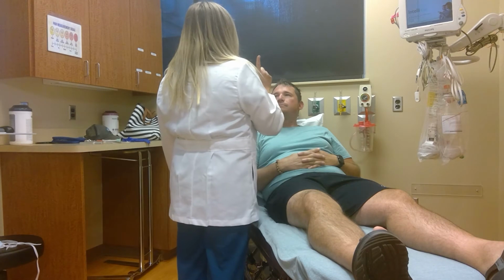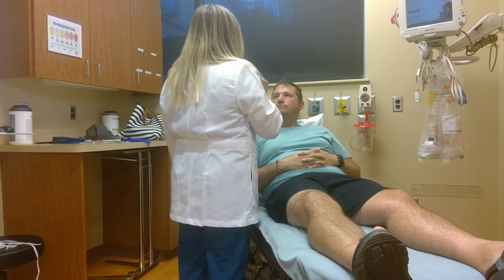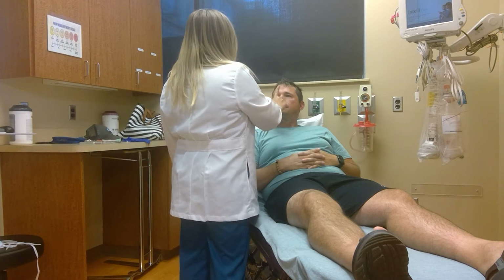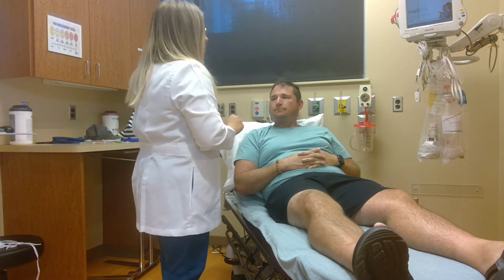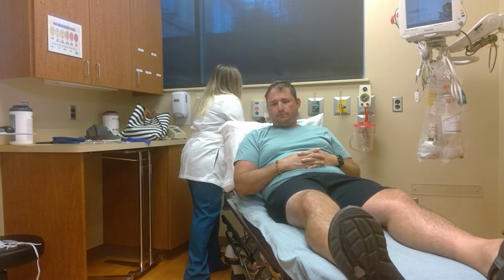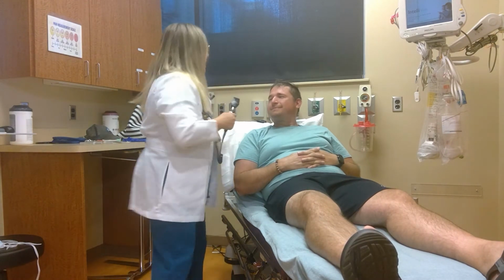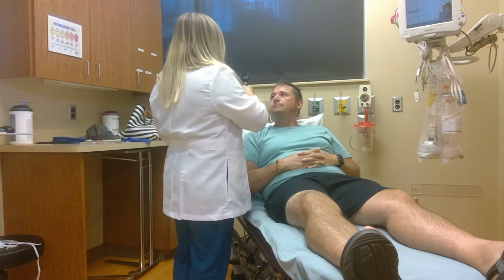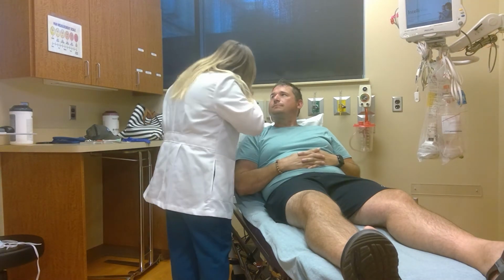I'm going to go ahead and bring my finger towards your nose. I want you to follow my finger with your gaze. Good, perfect. Accommodation, pupils, accommodation. Oh, I see this. I'm going to go ahead and assess your eyeball now, the inside of your eye. I'm going to go ahead and look through here.